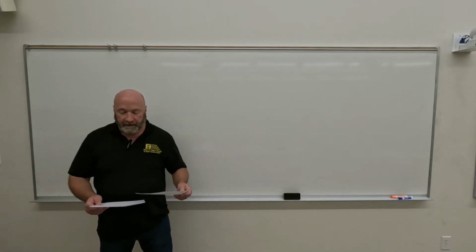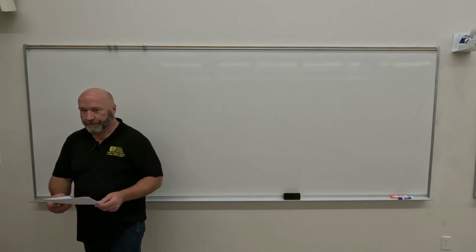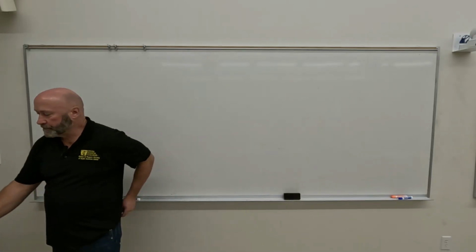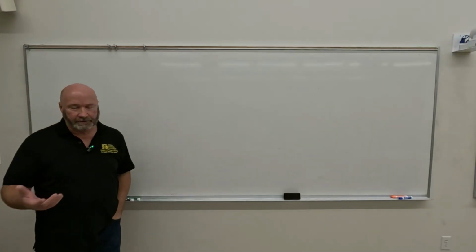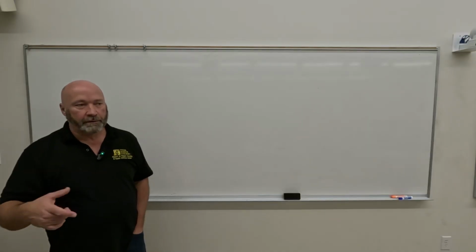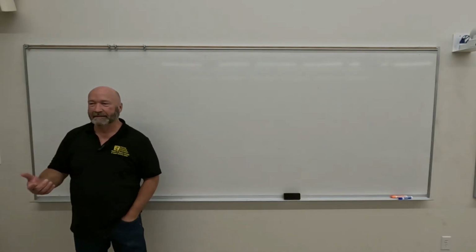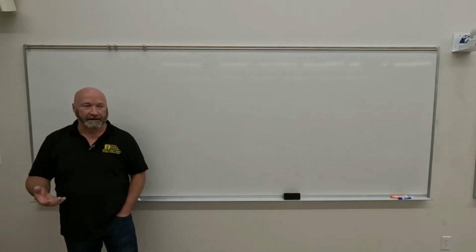So, any questions on Friday's lecture? No? Okay, then we're going to spend probably the rest of the day today talking about the anode specifically. If you remember, I brought down different types of anodes in the X-ray tube on Friday. So what you're going to be using is rotating anode. Limited exposure like dental units will probably be stationary anode.